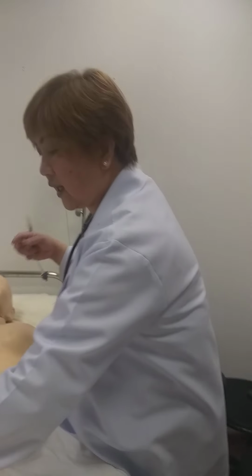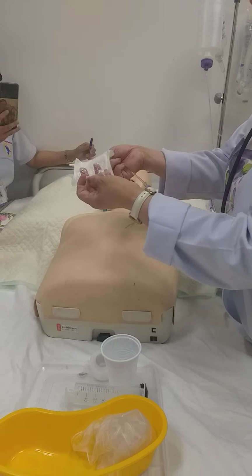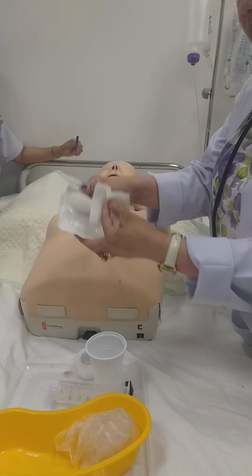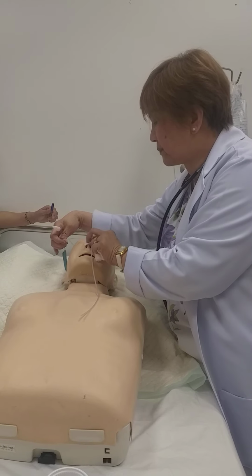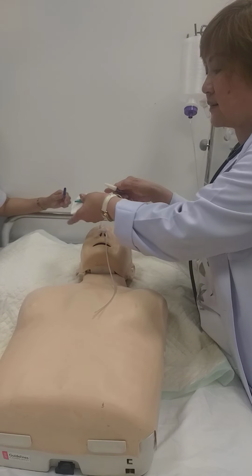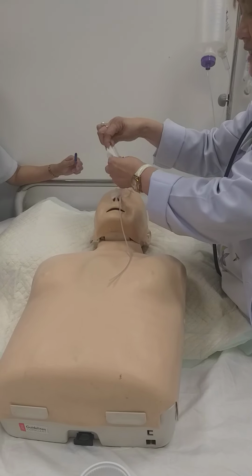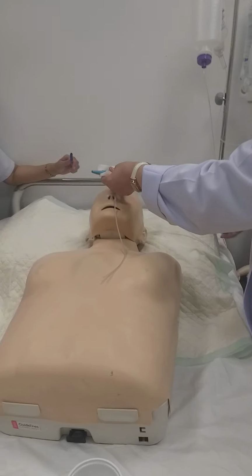Okay, so again, get a gauze. Opening of any sterile, you should open from the needle. Get a piece of gauze. Take it off from the cheek. Put the gauze under. Pinch open under to support, not to leak. And insert. Let's say it's inserted. Okay? Put it on.